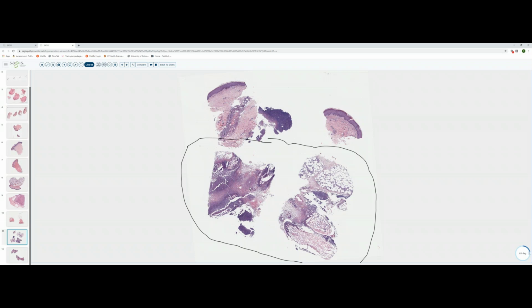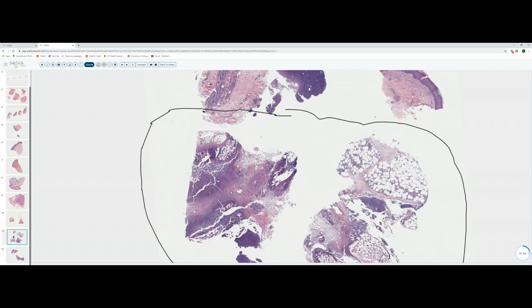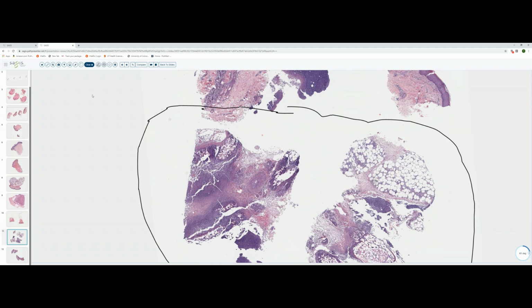Is it predominantly septal? Is it predominantly lobular? Even people starting out can see that this is a rip-roaring lobular panniculitis. There is extensive necrosis of the fat lobules here. Hard to even recognize this as fat.